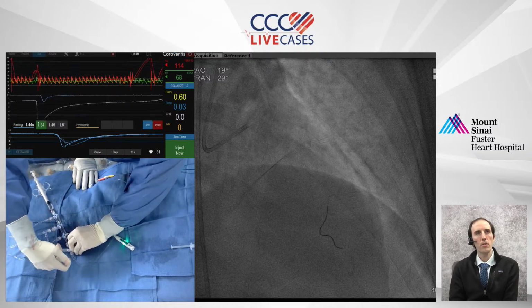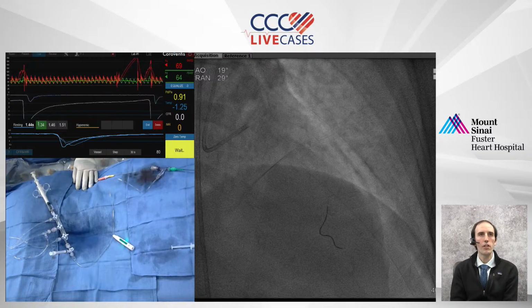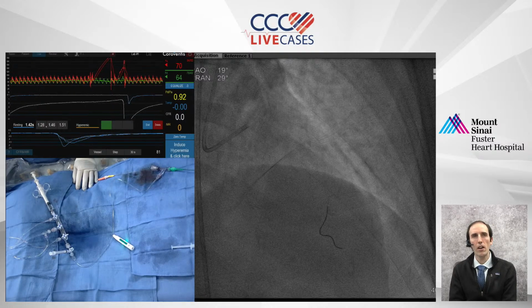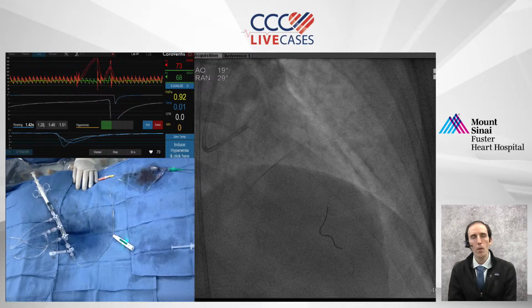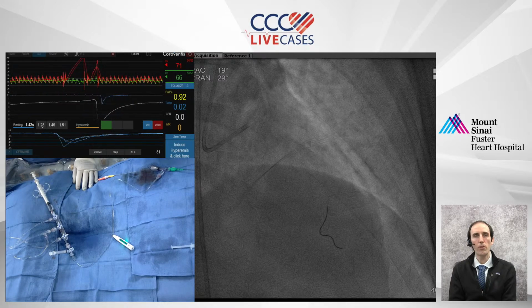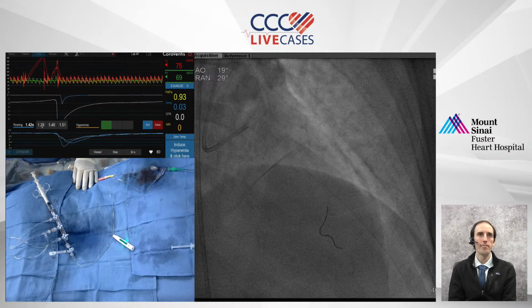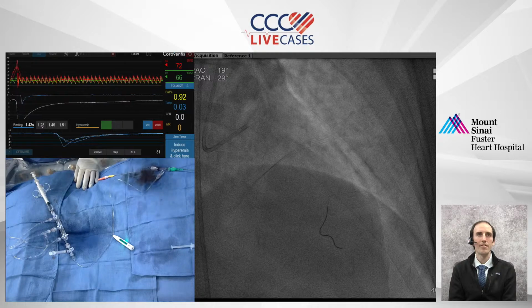So when I'm looking at these numbers, I'm often looking at both the curves on the lower part of the screen, but also the curves on that moving axis, because that can give you an indication that there's something wrong with your guide position, which is so critical. Maybe you can discuss more about this. I think that's a great point, Nat. Our learning curve was what we call injection hygiene. It is so important that your curves are at least within the same zip code. Not directly on top of each other, but you see these curves are in the same area.